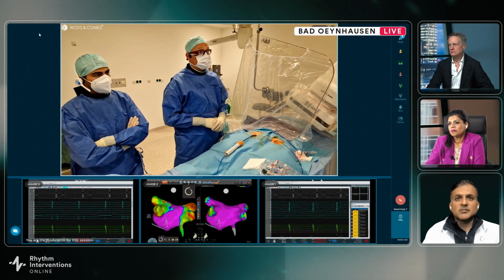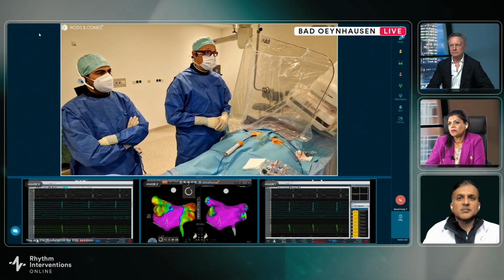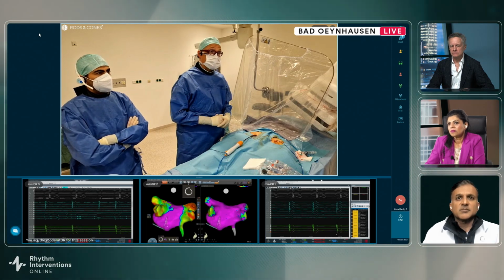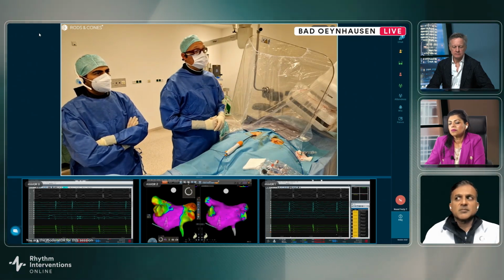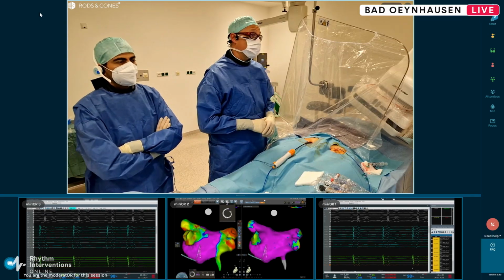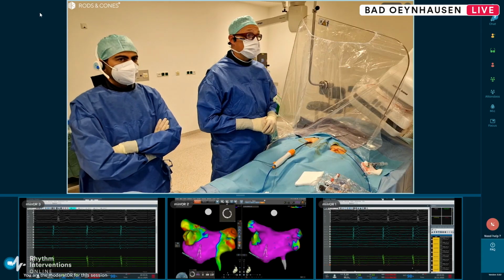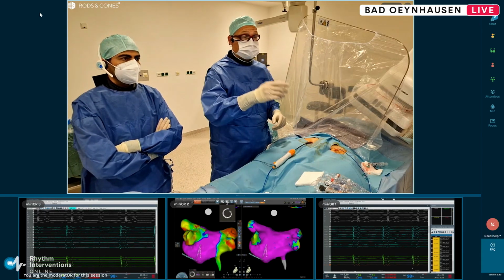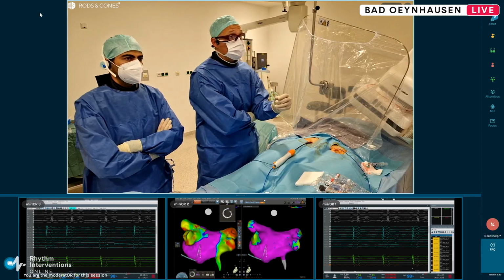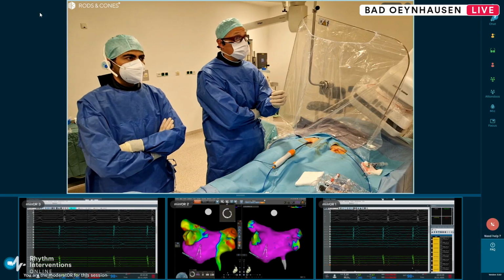But we have not observed such a problem. We have also not observed it performing other procedures in the ventricle, for example, using other devices. So it's something we have not yet seen. And we have also, fortunately, not seen any stroke or TIA event. And Alex can maybe also just report a little bit from his experience, that we have not seen any severe complications in these patients.